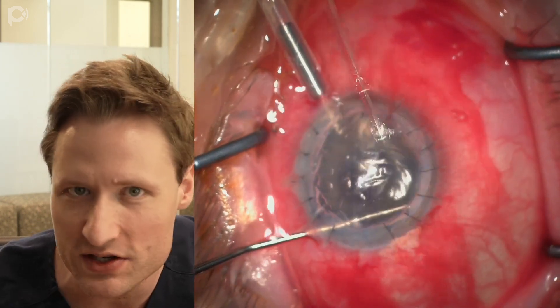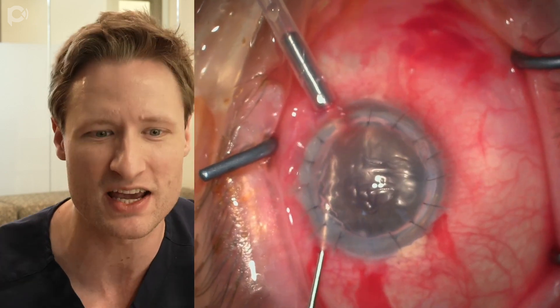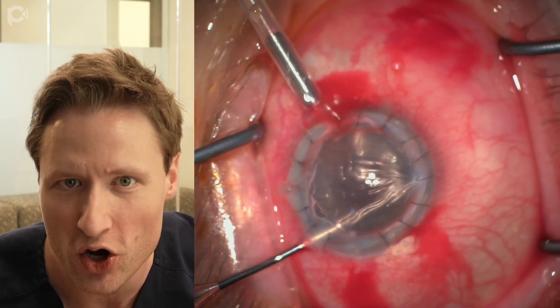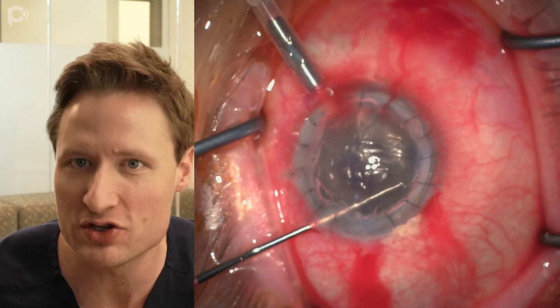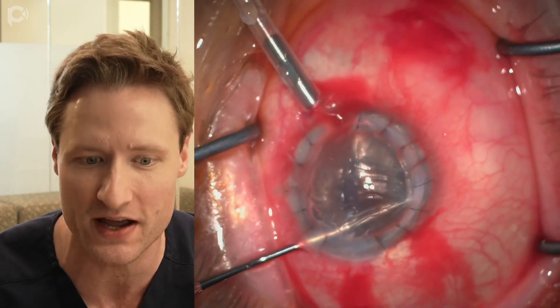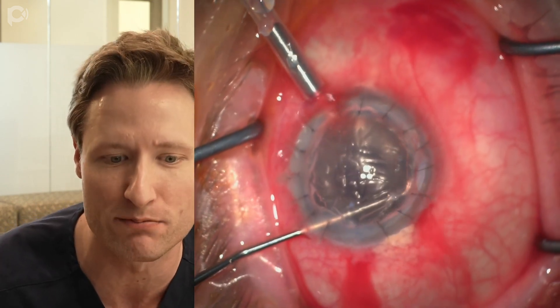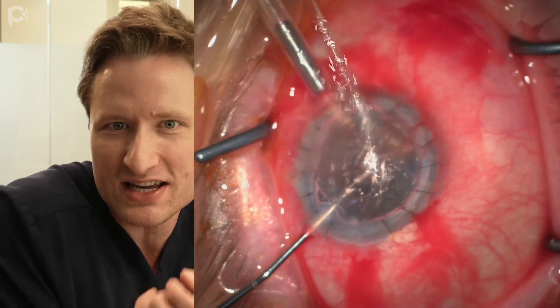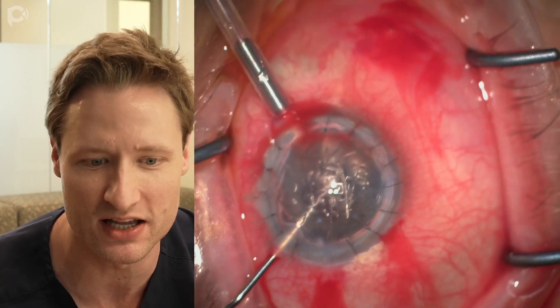I'm using an inverted Sinskey hook in this operation, and it's suboptimally sized for this case — just a little nubbin of a thing. I typically like to use a longer hook, which gives me better traction when engaging the posterior cornea. When I'm stripping around, you'll notice I'm not digging into the interface because I don't want to rip or dehisce the PK graft from behind. I'm carefully maneuvering the Sinskey hook just inside the interface, finding an edge, then picking and peeling at it.